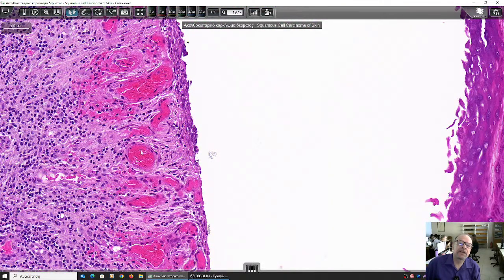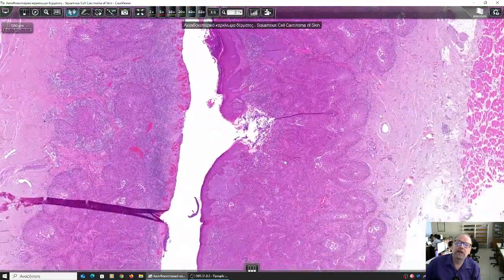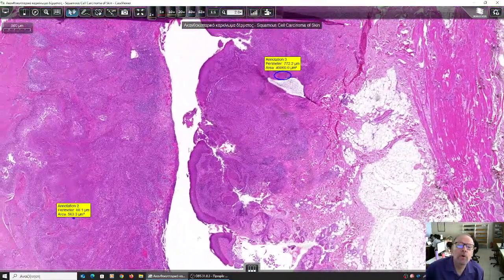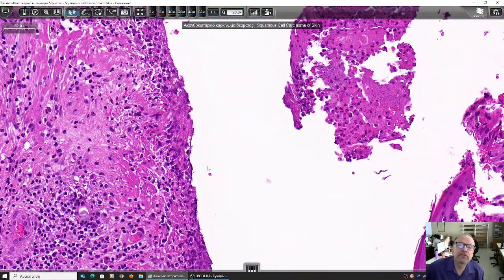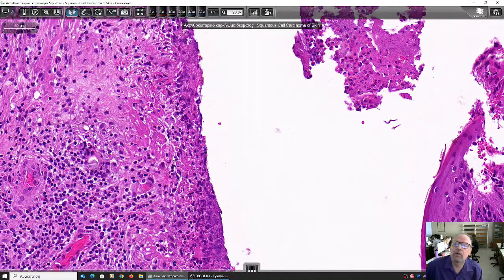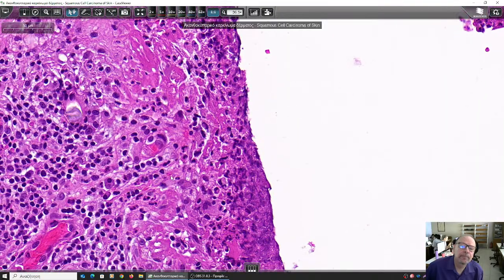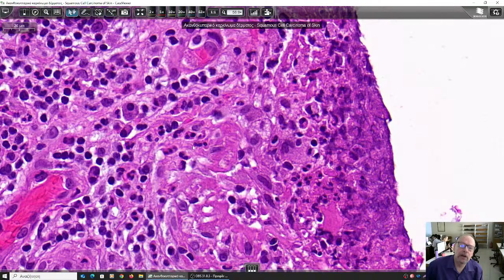No, we just see increased vascularity with too much blood, and in another area, in this area of the destruction of the epidermis, we see some inflammatory cells. Can you identify them? What are these cells? Look at their lobulated nuclei. They are neutrophils. So this is an area of acute inflammation.